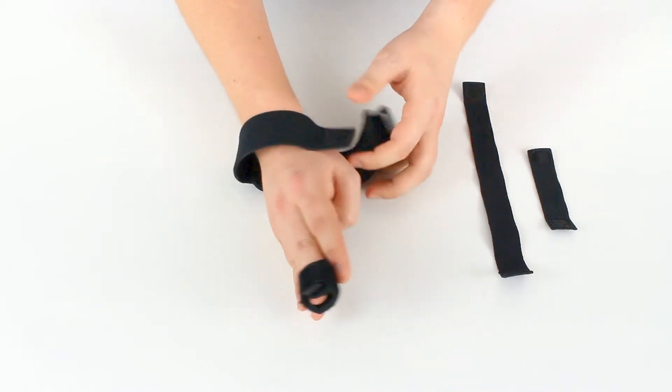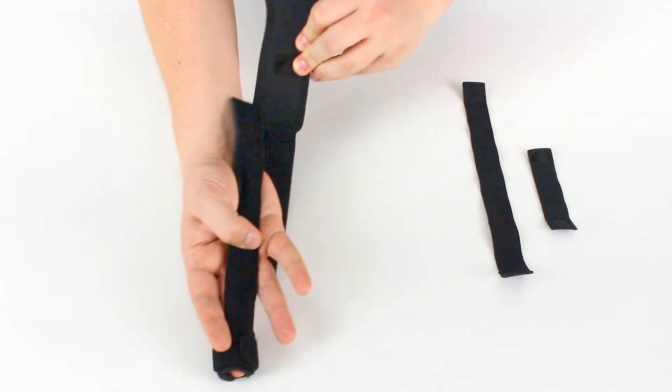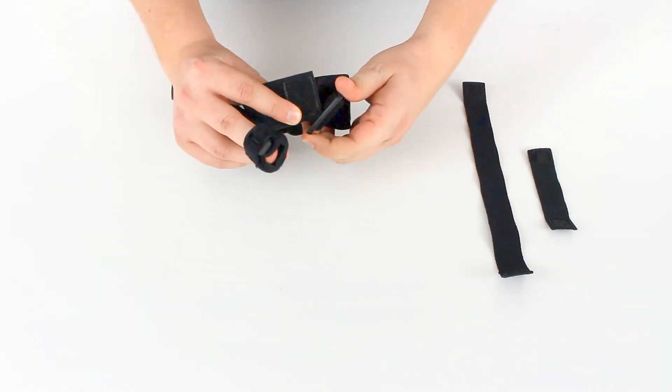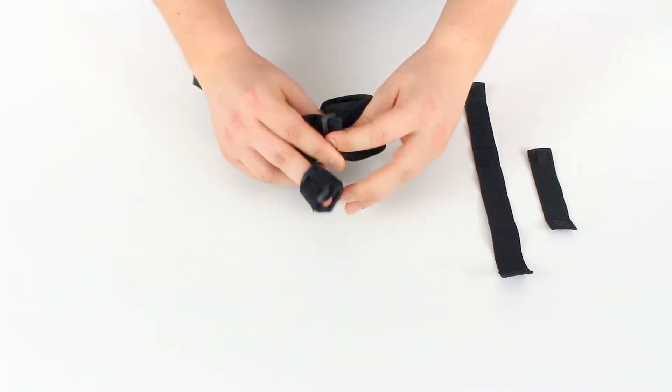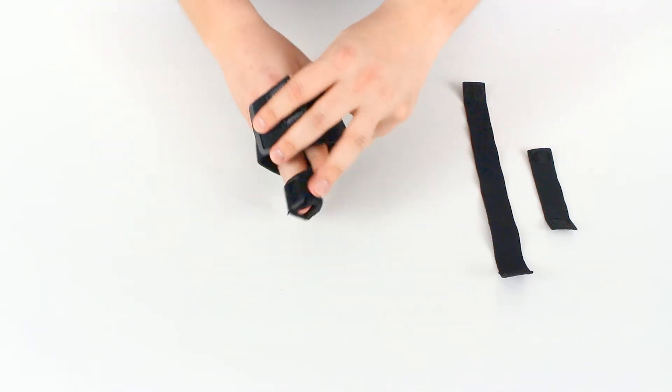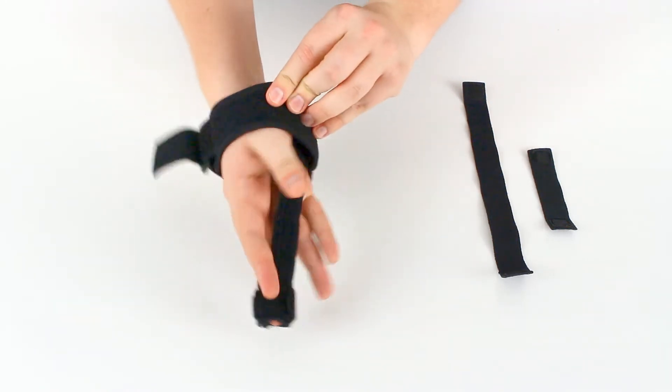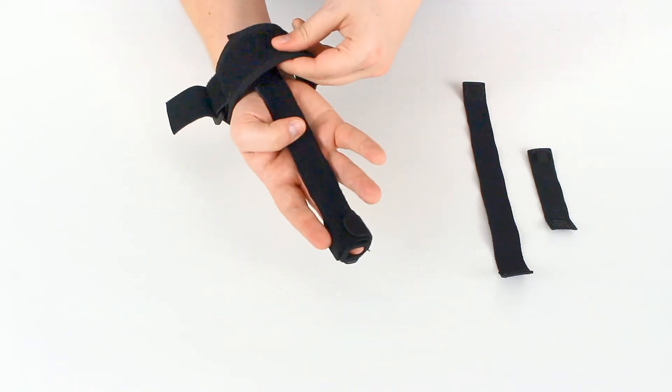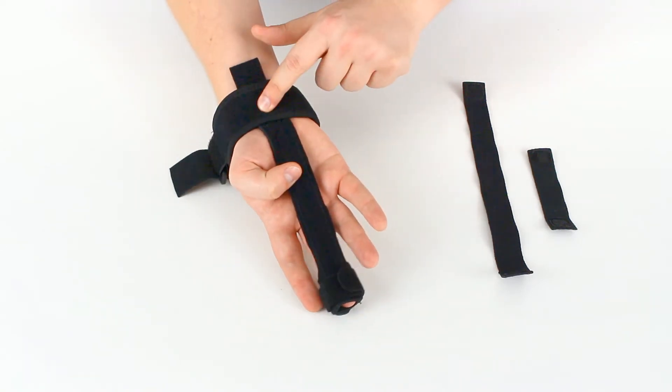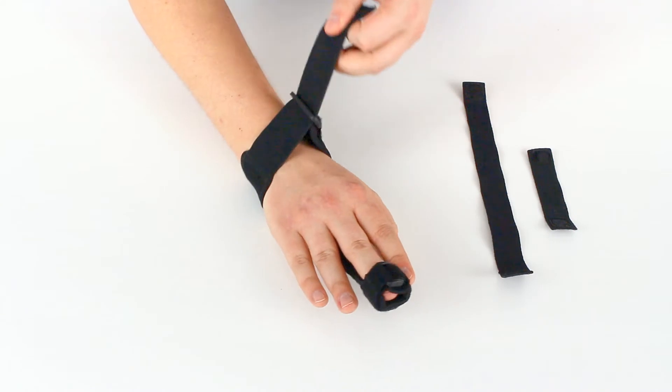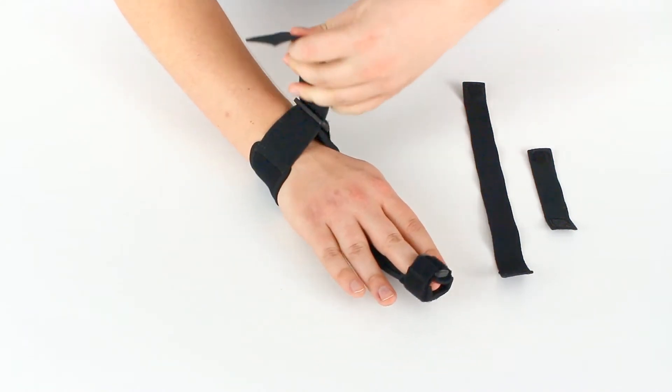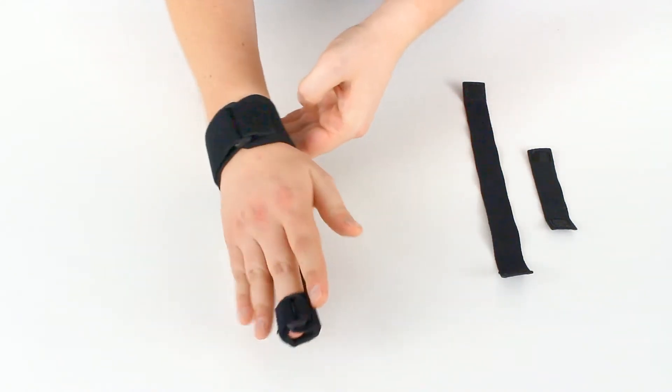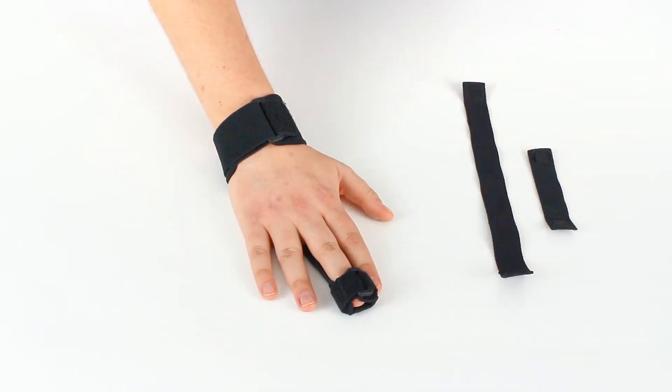This can also be removed and just run through this way if it's easier for you. And do that way. Fit your hand through. Position that velcro patch there. Wrap that around and secure it.